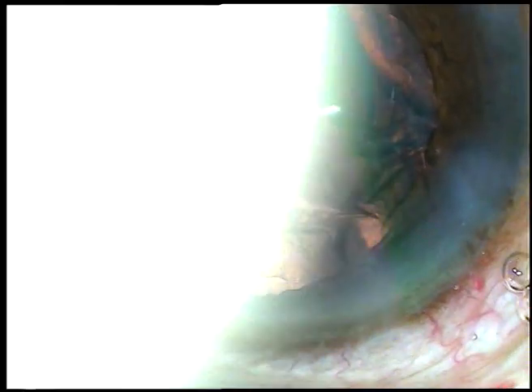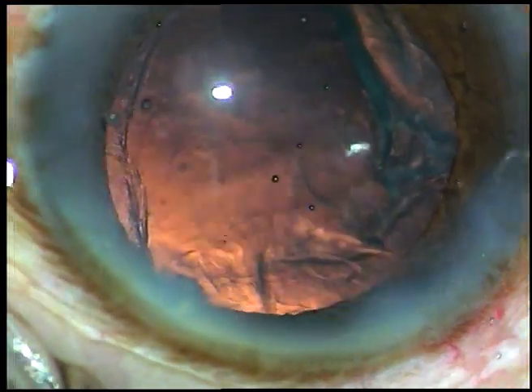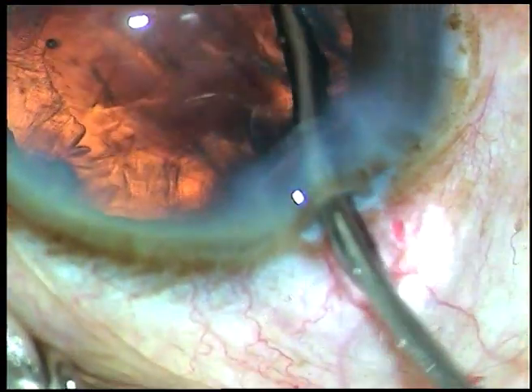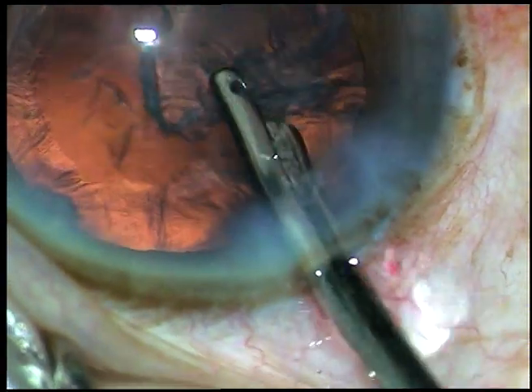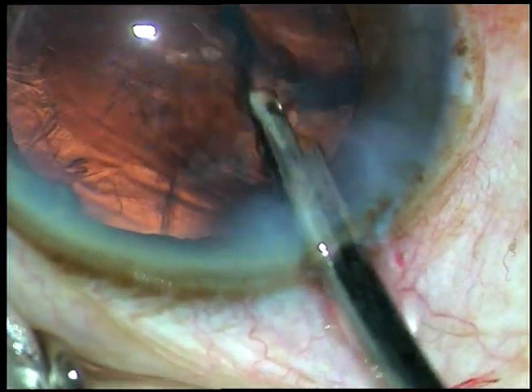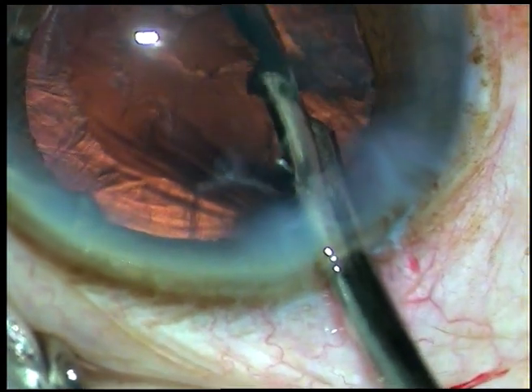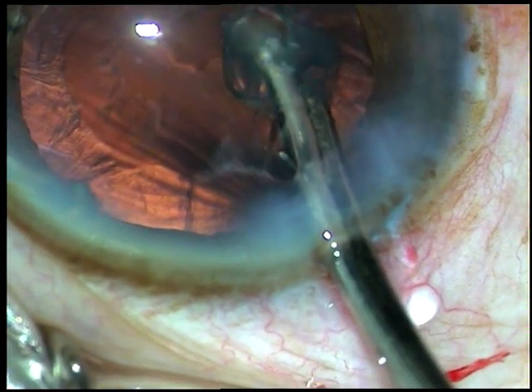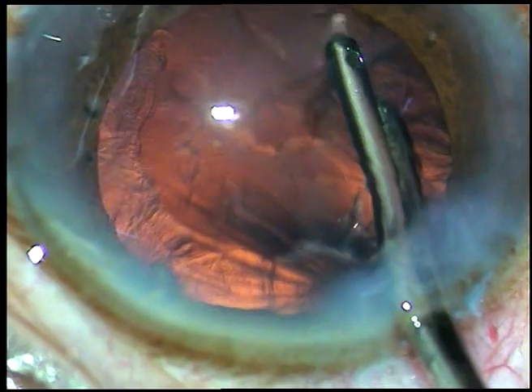Now my plan is to remove the cortex. I want to remove the cortex at 6 o'clock last, where the zonular dialysis occurred. So I am going to remove the cortex from all around except 6 o'clock. This is the cortex at 9 o'clock. Actually, there is a piece of epinucleus lying there.